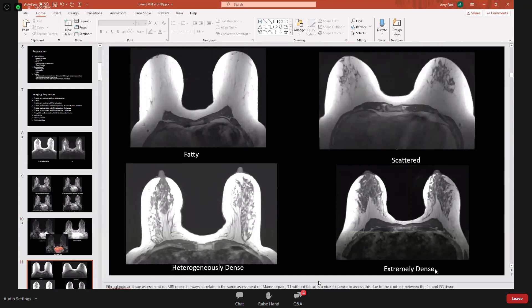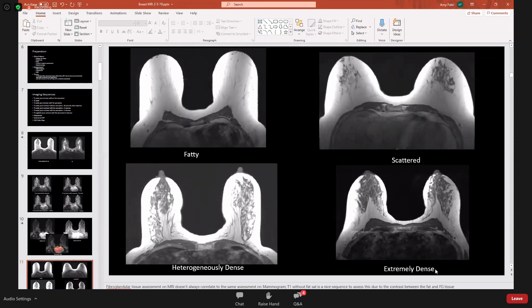Breast density on MRI is reported as fatty — with just wisps of fibroglandular tissue — scattered, where areas of fibroglandular tissue begin to appear; heterogeneously dense, where fibroglandular tissue is more prominent; or extremely dense, where fibroglandular tissue predominates over fatty tissue. These density assessments are made on T1 sequences without fat suppression, where fat appears brighter.